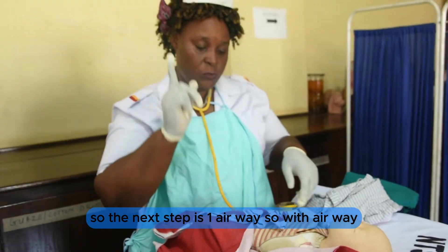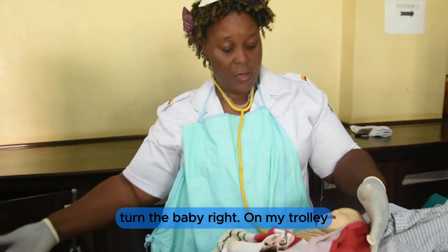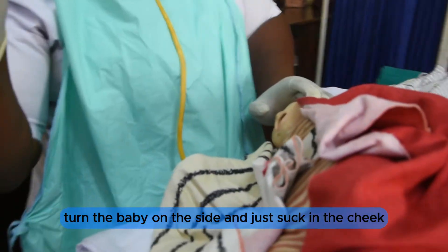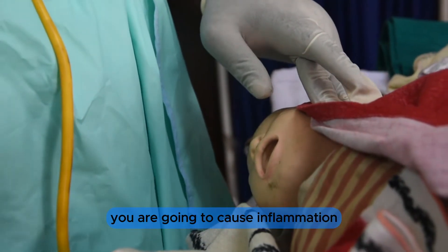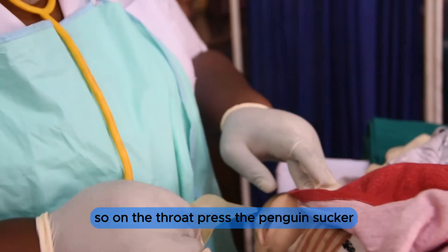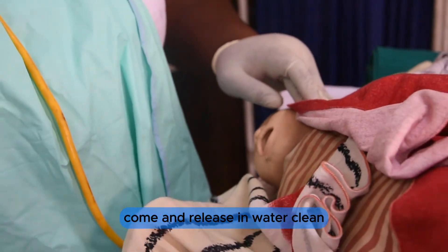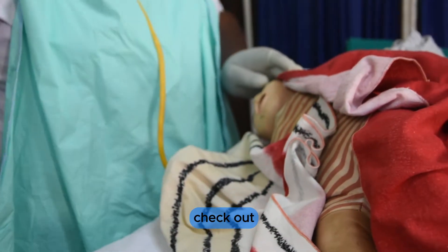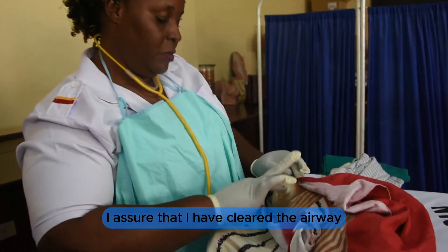Next step is A — airway. I turn the baby on my trolley and pick up the penguin sucker. I turn the baby on the side and suction in the cheek, not on the throat, because suctioning the throat will cause inflammation. Press the penguin sucker, go in, release as you come out, then clean in water. I assume that I have now cleared the airway.